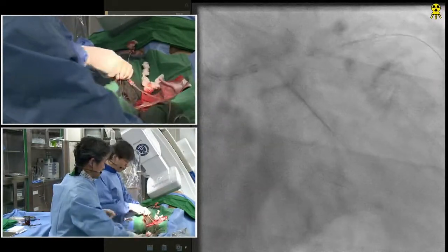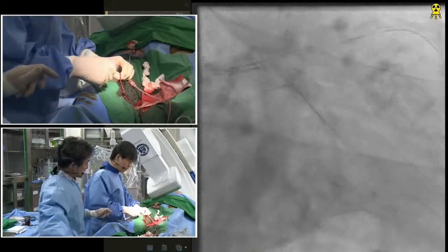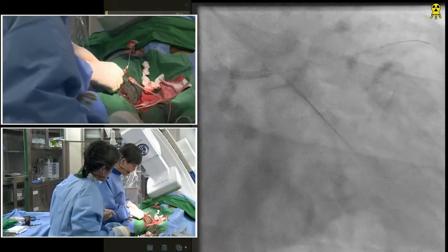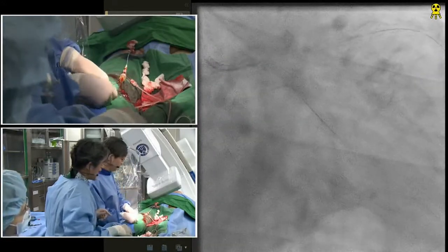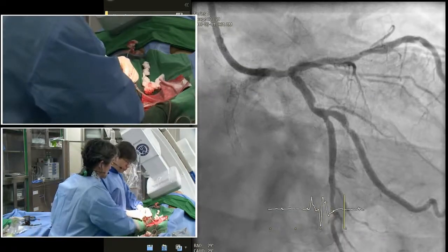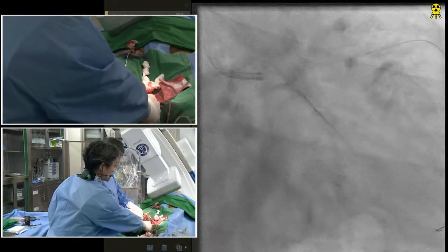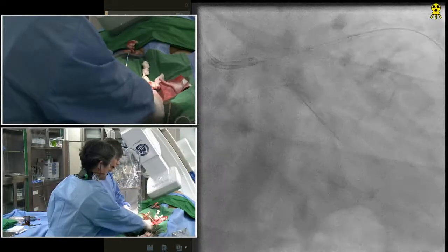and then I will deploy another synergy stent from the distal left, proximal LAD to the left main. Just one question. Are you going to overlap with the mid-LAD stent, or are you going to just put... No. If there is some normal segment of the coronary artery, just let it alone. I'm intentionally not doing the overlap.